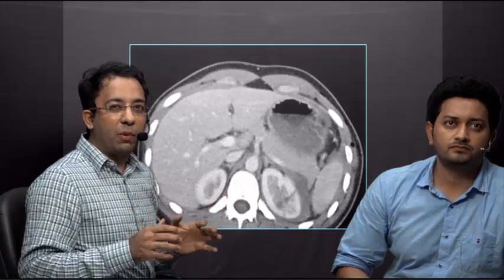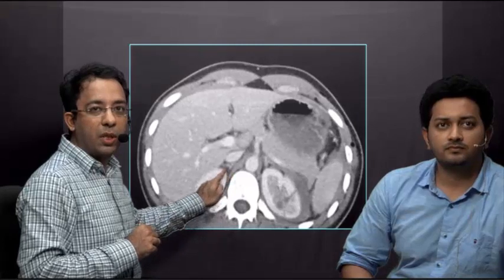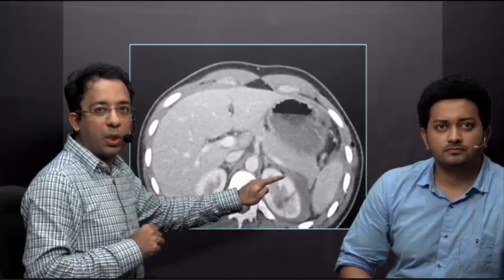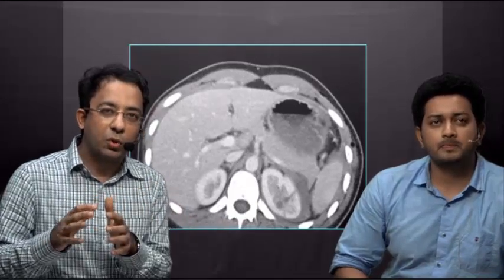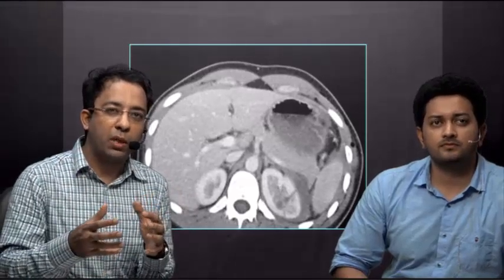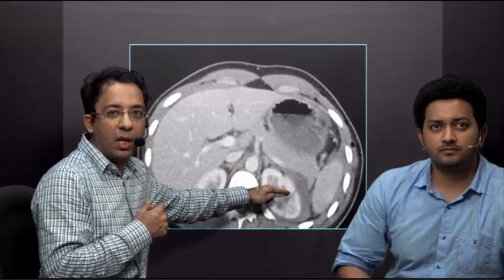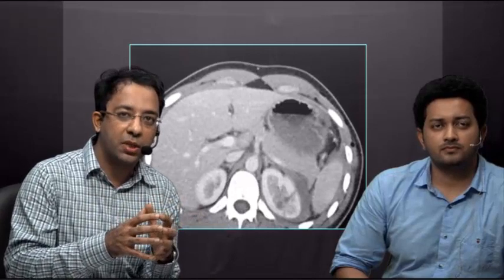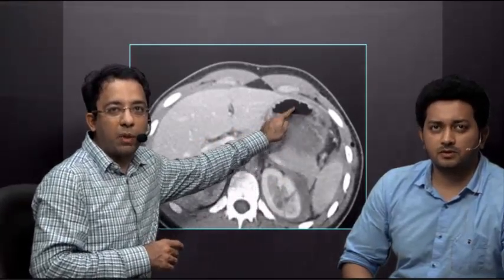In the next patient we have more anatomy visible: liver, portal vein right branch, right kidney, adrenal, IVC, aorta, left kidney, spleen, pancreas, and stomach. There is a perinephric hematoma around the left kidney. To differentiate a hematoma from a urinoma, we look at Hounsfield units: 30 and above indicates hematoma; 0 to 20 indicates urinoma. Here the cortical laceration is more than 1 centimeter in size but does not extend to the pelvicalyceal system — so we call this Grade 3.